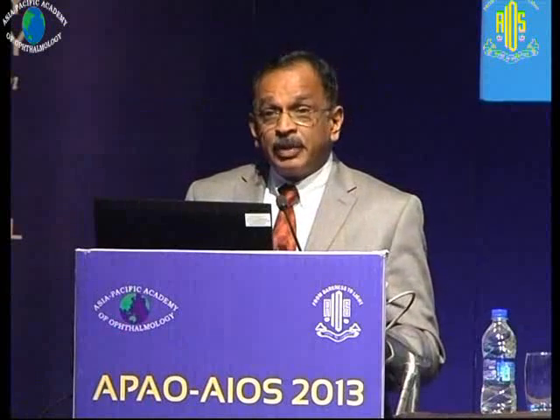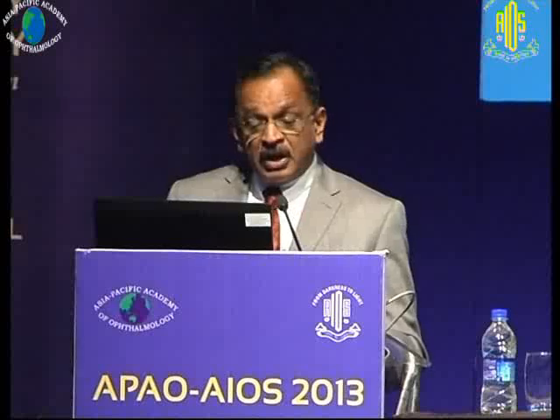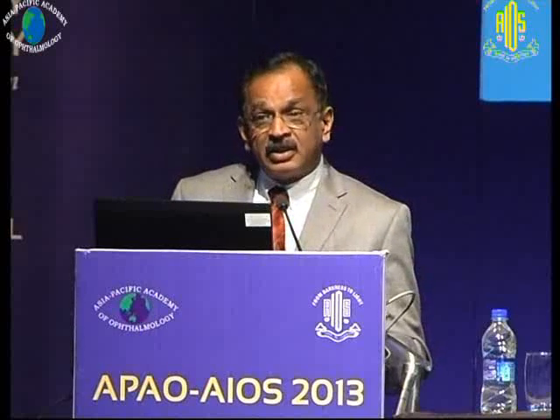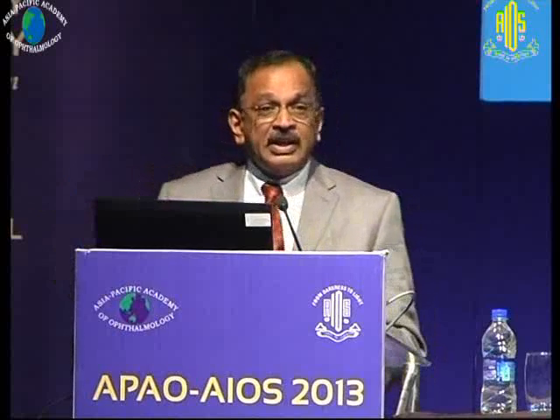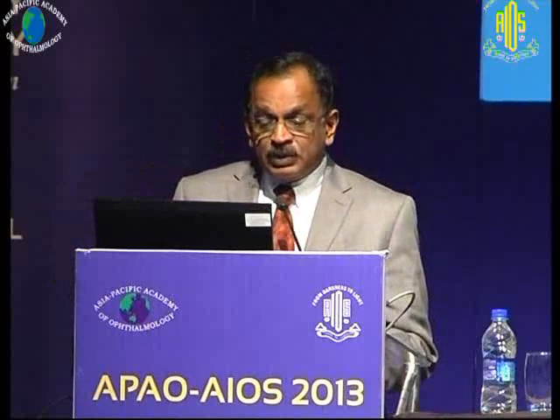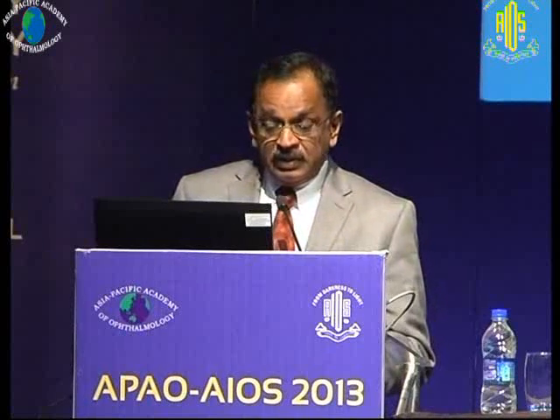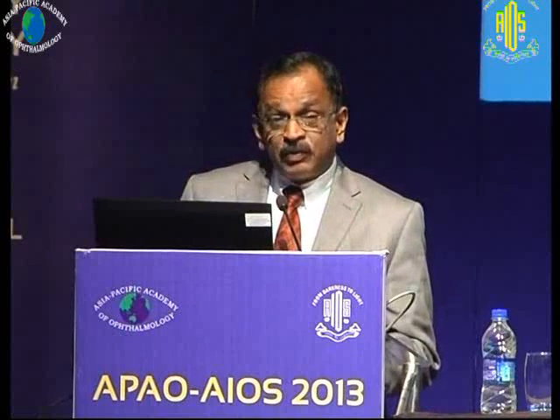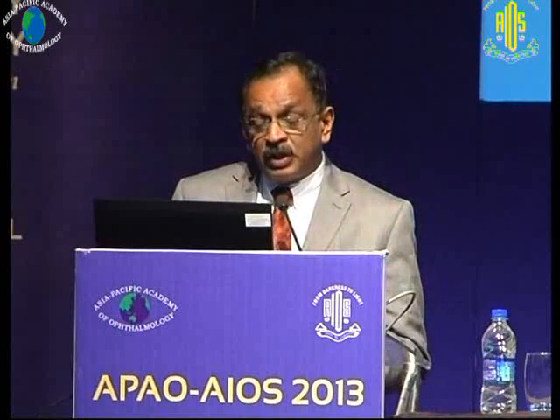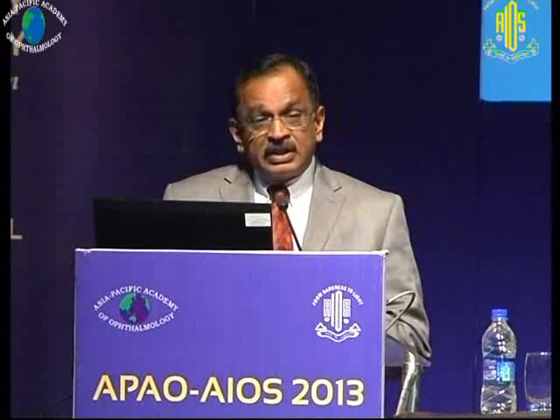At least some people suggest 2 rows of diathermy to prevent bleeding from these edges, but again, diathermy could be counterproductive in some situations, folding the edge of the retina. So you do what is adequately required for that situation, and the advantages are that it prevents bleeding, and of course in some cases when you're doing a fluid air exchange, you will be able to identify the edge of that retinotomy or retinectomy.